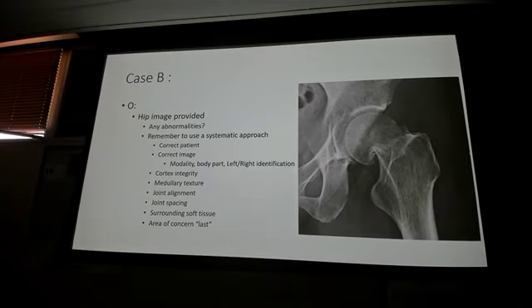So you order the hip x-ray, or the femur. Nice part about this area of the body, if you said pelvis, you would get this answer. If you said femur, you would get this answer. If you said hip, you would get this answer, because they all have the same part of the body that we're concerned about. I'm not really caring which one you would order, as long as you're in this general area, read your x-ray.